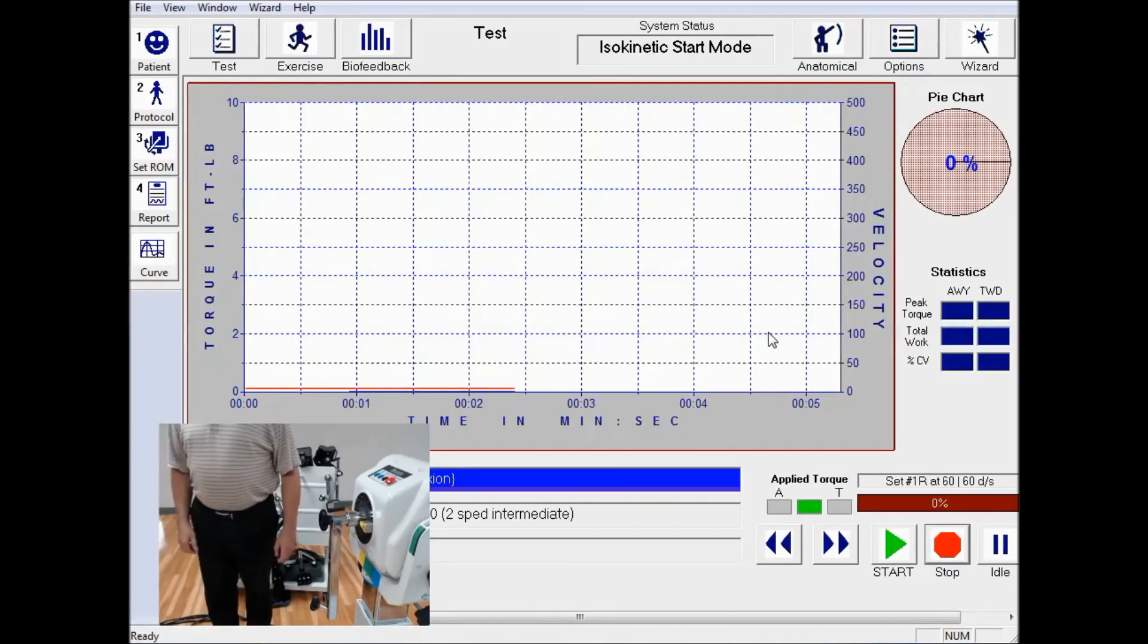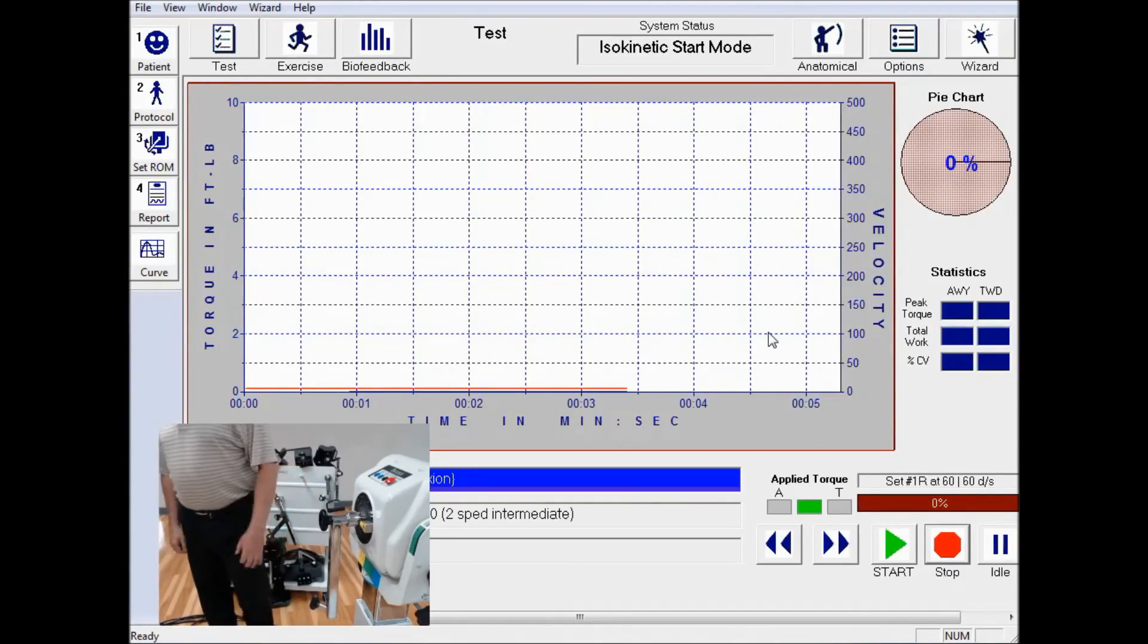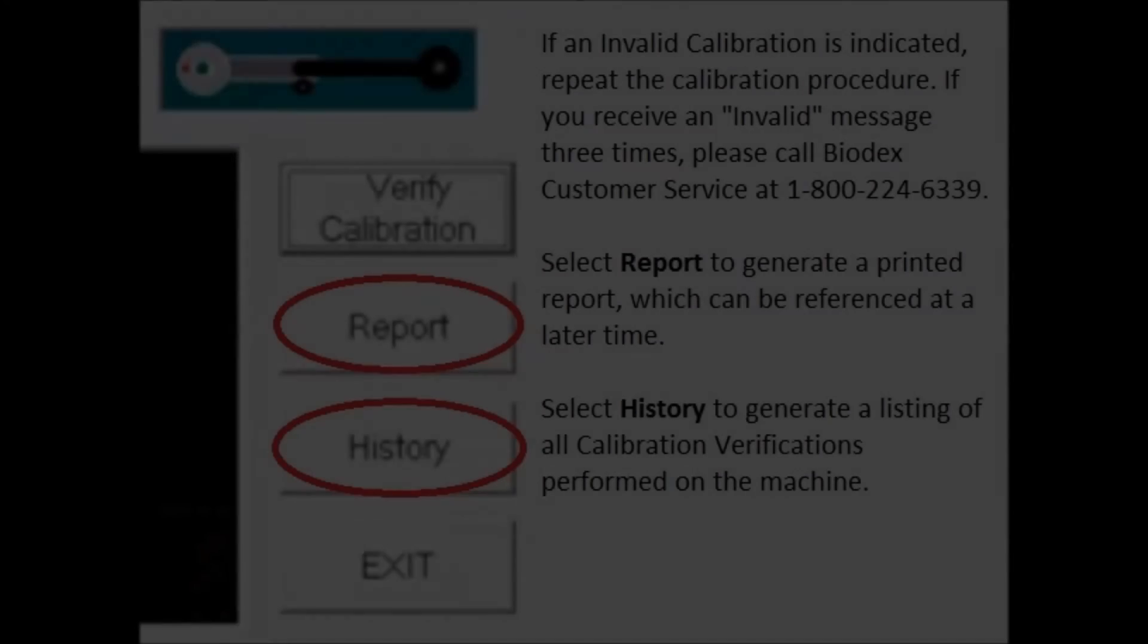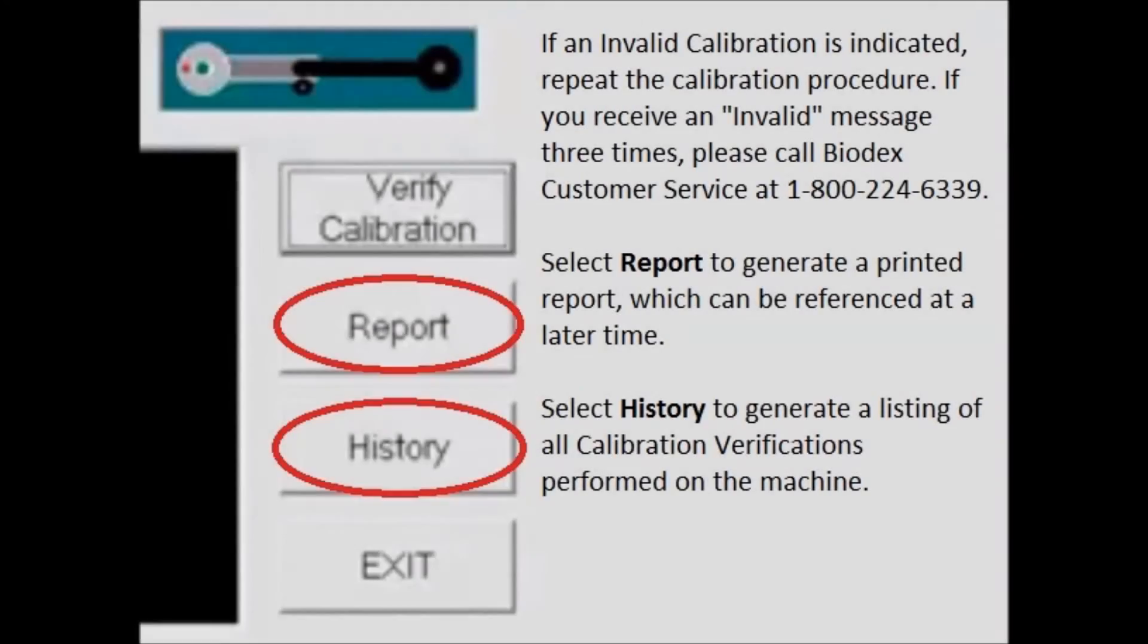That concludes the calibration. Select Report to generate a printed report, or History to generate a listing of all calibration verifications performed on the machine.